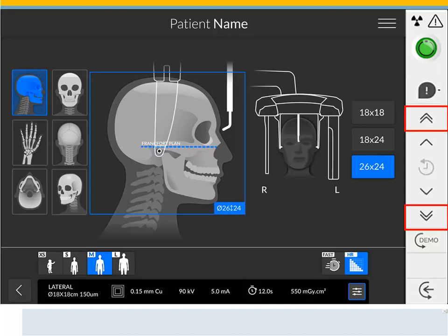Fast Height Adjustment Button: press and hold up or down for fast adjustment of the height of the unit to the height of the patient. Slow Height Adjustment Button: press and hold up or down for slow adjustment of the height of the unit to the height of the patient, especially for the final adjustment.